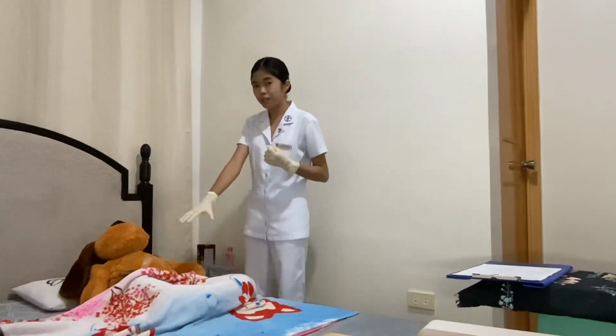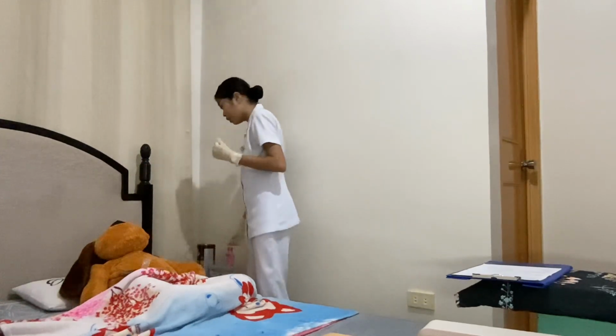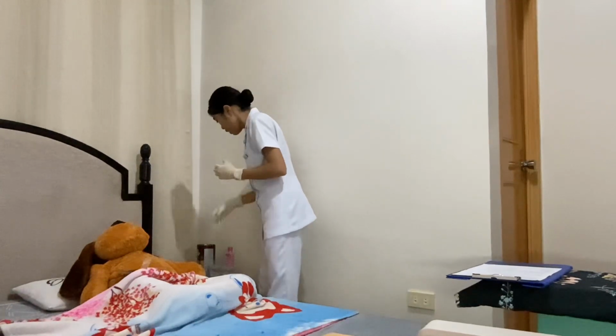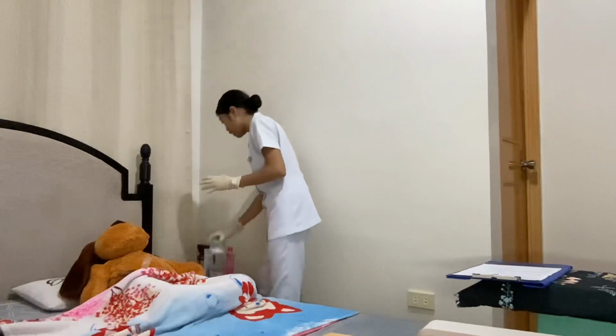Now that we have already exposed the patient's abdomen, what we're going to do is to prepare the medication. But first, we're going to clean the injection site by using a cotton ball soaked in 70% alcohol.